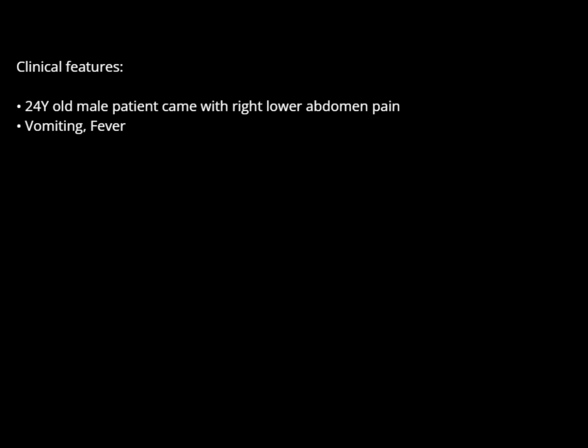Clinically, this points straight to acute appendicitis, but when we place the probe on the right iliac fossa, the sonographic presentation reveals that the disease has already progressed to a major complication. So let's look at the images, what we got.